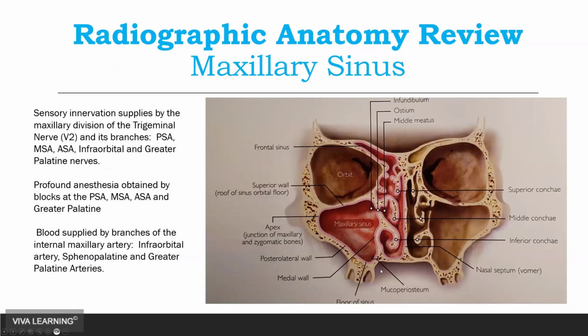Okay. So the sinus, if you're placing implants or just getting into implants, it is inevitable that you will do sinus lifting.